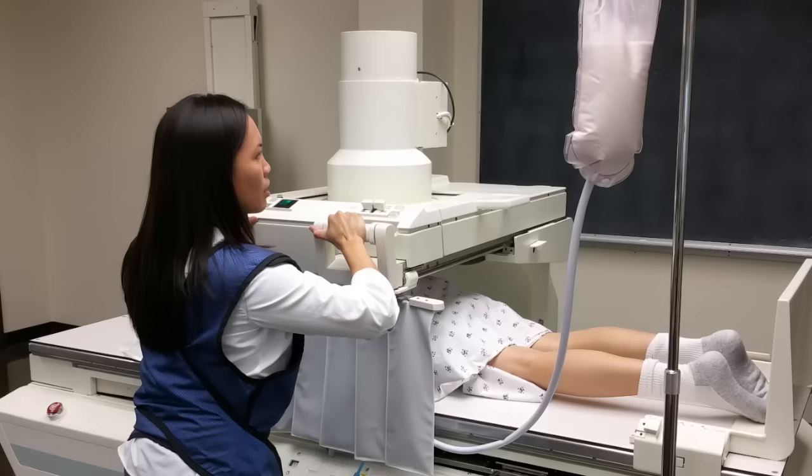Make sure you instill air slowly, otherwise the patient experiences severe discomfort and it might incite rectosigmoid spasm. I like to instill two to three puffs with intermittent fluoroscopic pulses, position the patient, then again instill two to three puffs, and keep doing so until the colon is properly coated and distended. Spot images are taken of the rectum, sigmoid colon, hepatic and splenic flexures, and cecum, but the order doesn't matter as long as each loop of colon has adequate barium coating and distension with as little superimposition or overlap as possible. I try to make sure I take a couple good double contrast images of the sigmoid colon — usually with the patient supine or in a slight supine oblique — before the barium reaches the cecum, since reflux through the ileocecal valve could cause superimposition of the distal ileum on your sigmoid spot images.